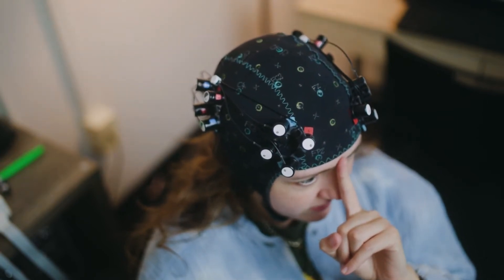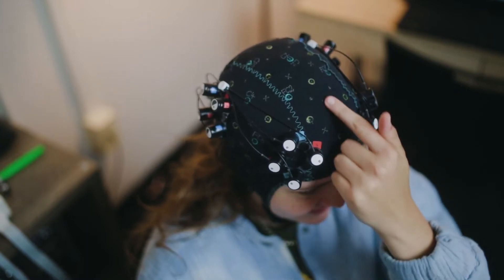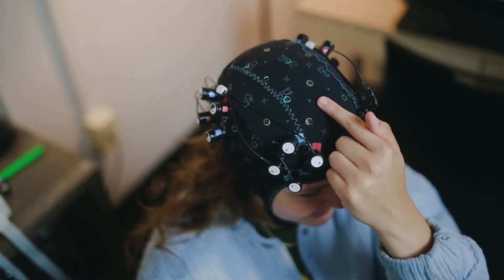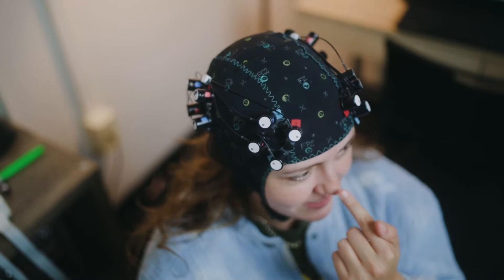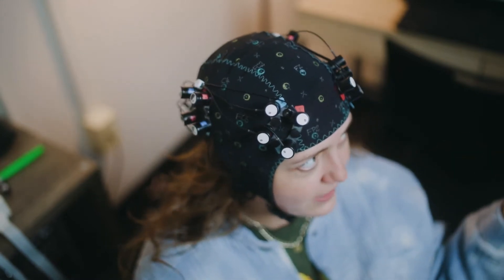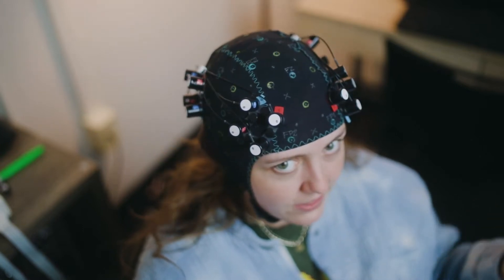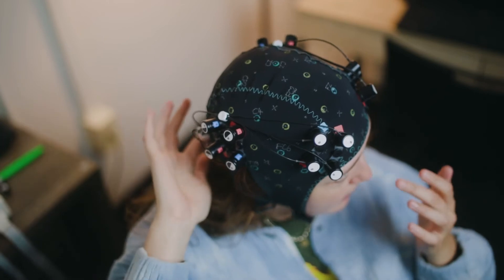Make sure it's centered — using the yellow center slit circle on the cap confirms it's centered. That means the cap is roughly in the right place. You'll also always take the measurements of the cap: the Inion and Nasion, so ear to ear and then from nose to the back of the head.